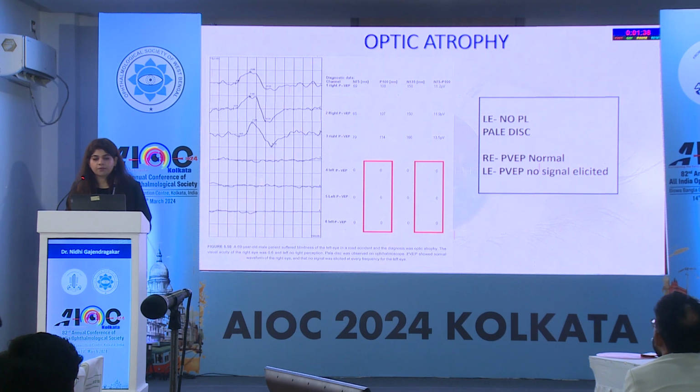This is a case of a patient having optic atrophy with the left eye having no PL. In the left eye, no signal is elicited versus the right eye, which was normal.